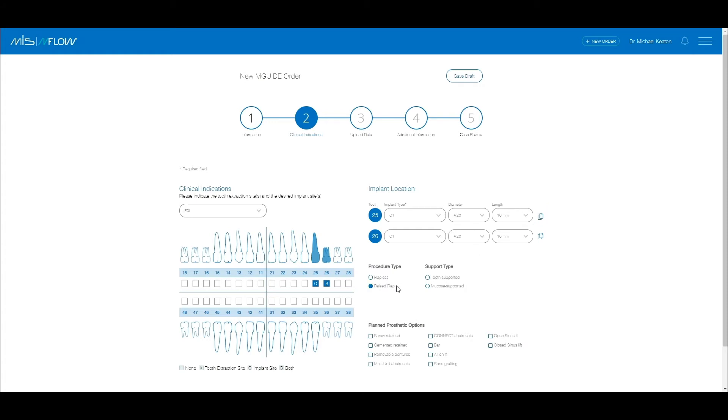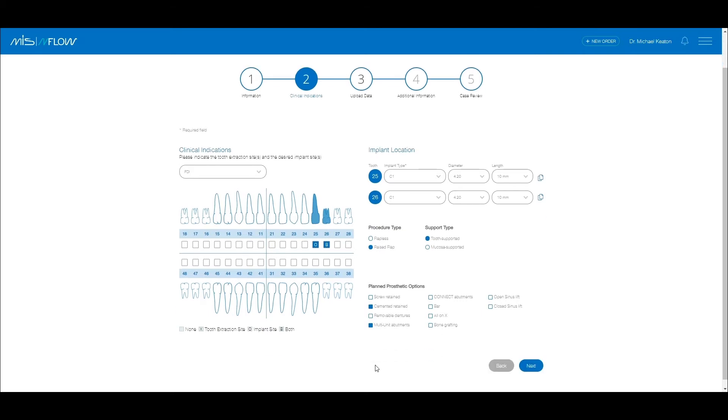Select the procedure type and guide support type. Select the plan prosthetic options. This additional information will help the mCenter to create an optimal plan for the case. Click on the Next button.